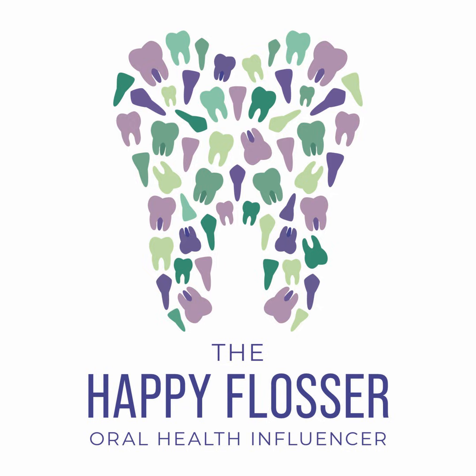One of the skills that you have to develop and takes a lot of practice is taking a really high quality diagnostic set of radiographic images. And you're going to spend a lot of quality time with Dexter while you're enrolled in school when you take radiology. And that's one of the main stressors of radiology.